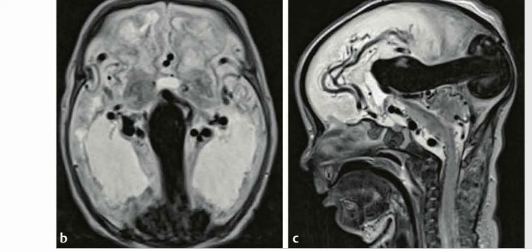So considering the key finding here of a large vascular malformation which is draining from the tectal region to the superior sagittal sinus in a neonate patient, the diagnosis here is of vein of Galen malformation.